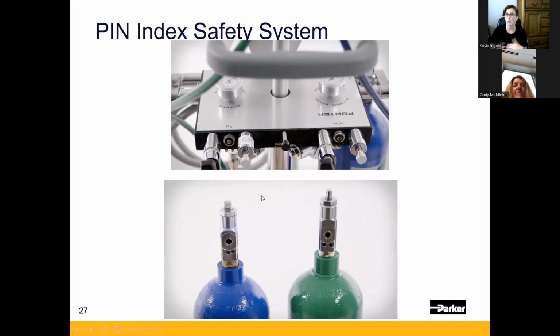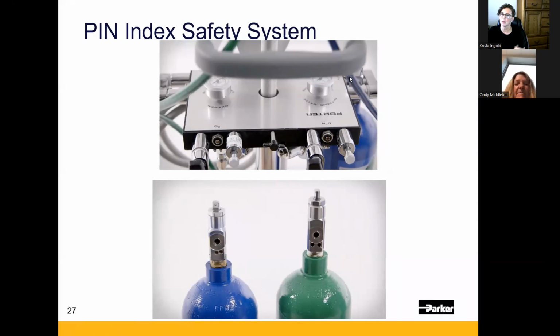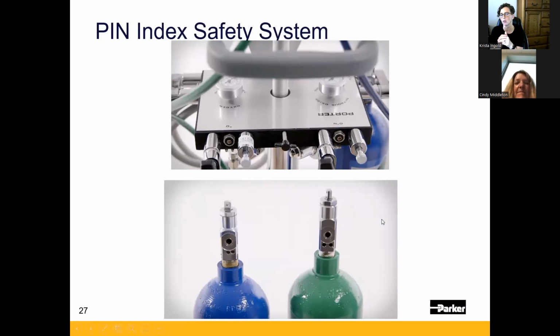Oh, okay, when you pull that towards you, that will then basically allow you to tighten that T-handle down. As you tighten the T-handle down, now don't go crazy on it. A lot of people just crank on that black T-handle. The problem with that is that ultimately you're pushing that cylinder into the platform, which is fine. The problem is you're squishing your washer.